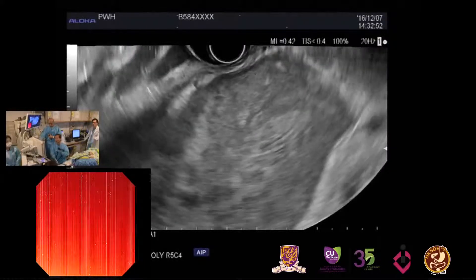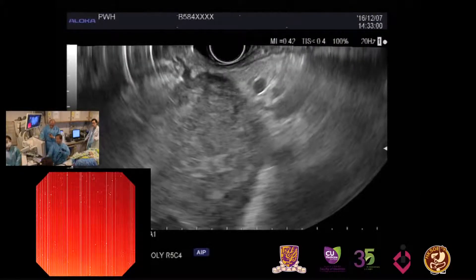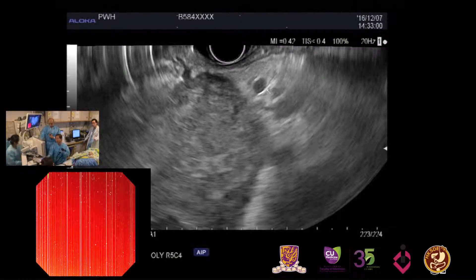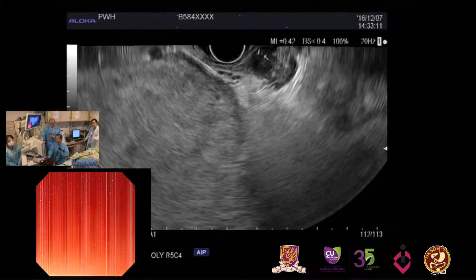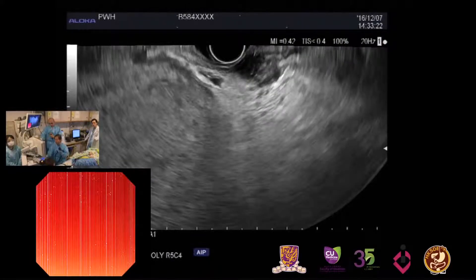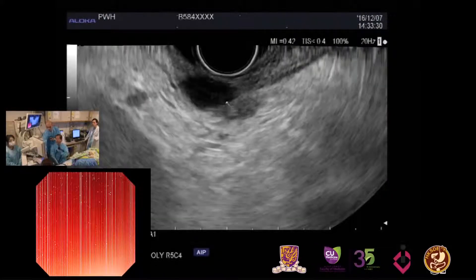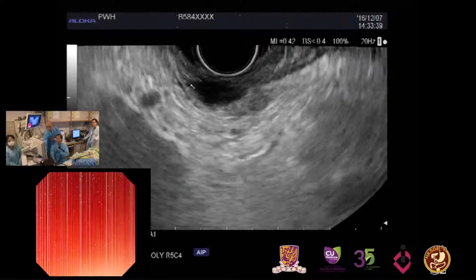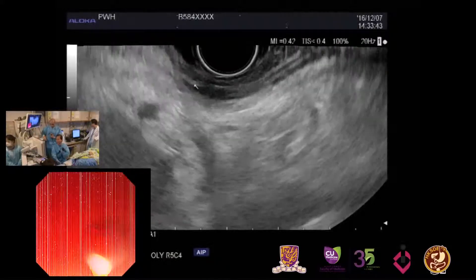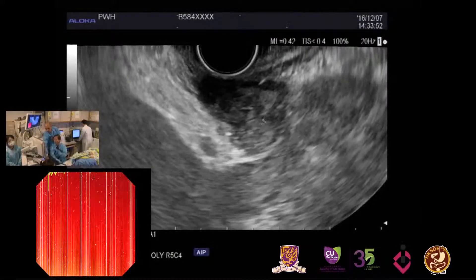So it may look like a pancreatic or retroperitoneal region. But if we trace this region a little bit more, you can see a little bit of pancreatic tissue here, and the splenic vessels are here. I am trying to trace the region. Suddenly we can see another hypoechoic mass here, and also here and here — these are all masses. If you just focus on this near-side mass, I think everybody would probably agree that this region is actually connected with the muscular layer on the other side. It is connected to the proper muscle layer of the gastric wall here, and if we trace this region a little more, then this region is connected to the outside mass.